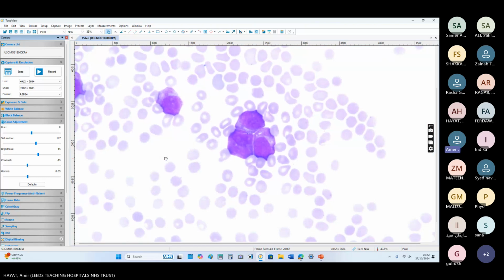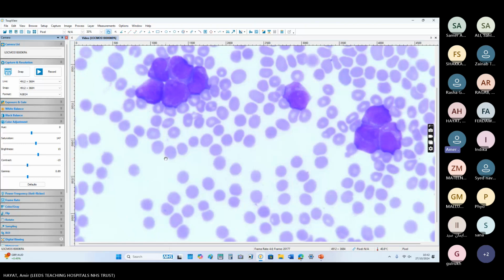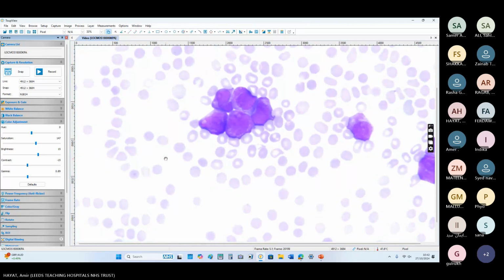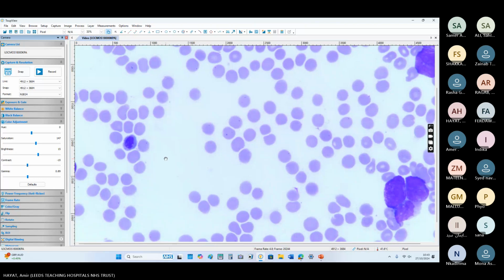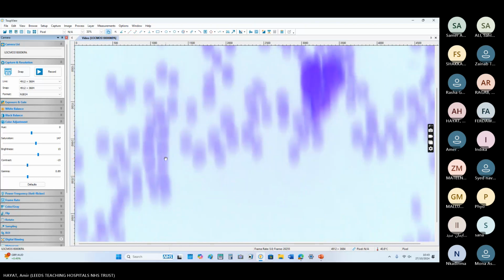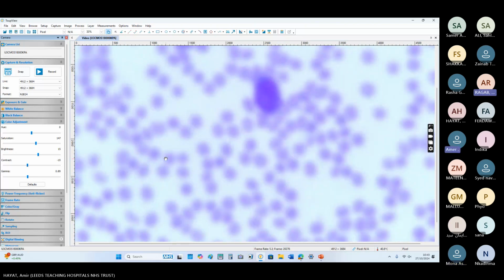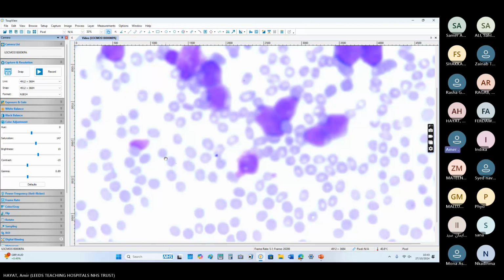Excellent. You have asked the question that I was hiding. The white cell count is 20. So ATRA and idarubicin. Yes, ATRA and idarubicin.